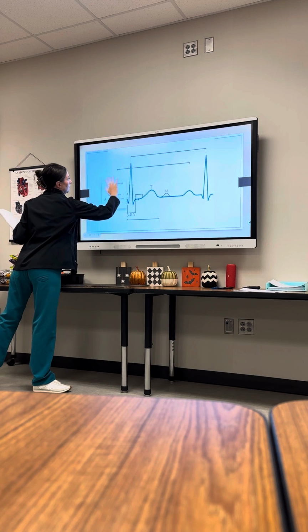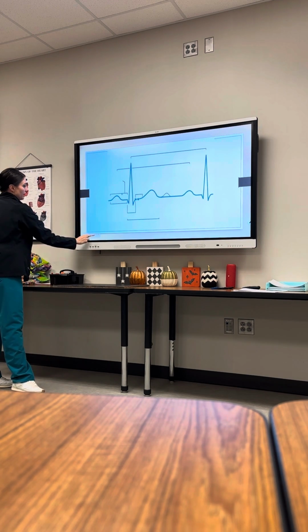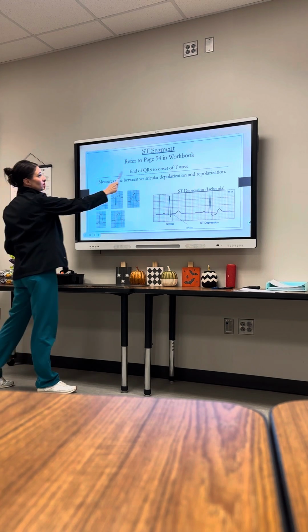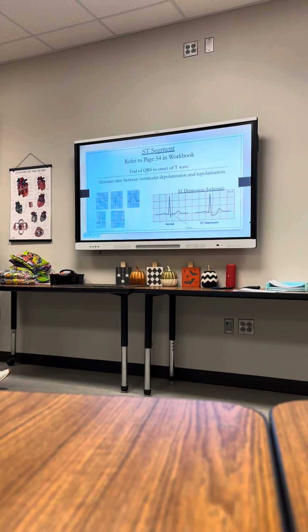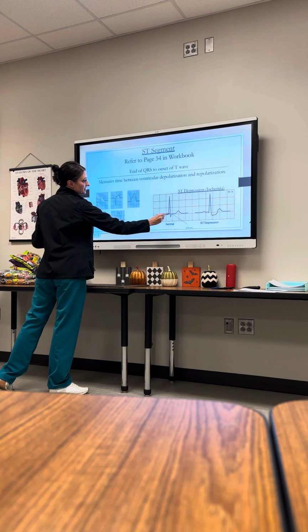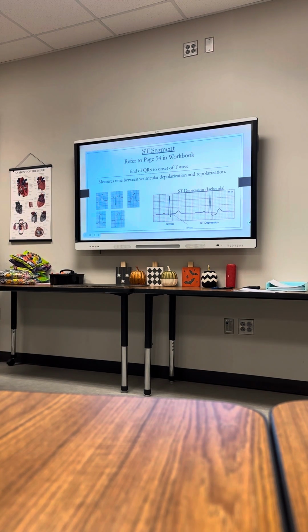Okay. Let's talk about a new segment, and this one's really important. We're going to talk about the ST segment. So what is it? It's the end of the QRS until the onset of the T wave. So it's that line after the QRS until the onset of the T wave. So what are we measuring here? We're measuring the time between ventricular depolarization and repolarization.